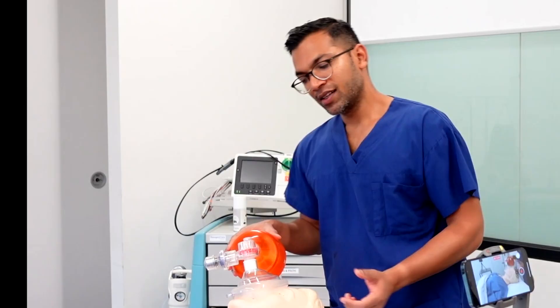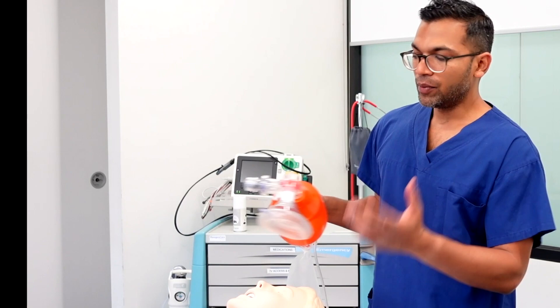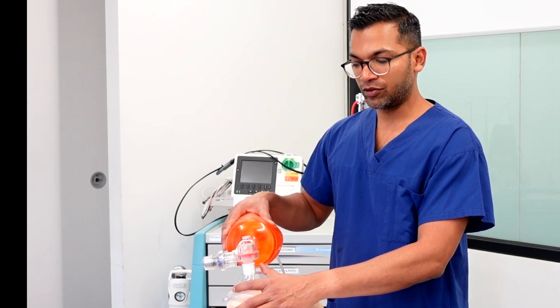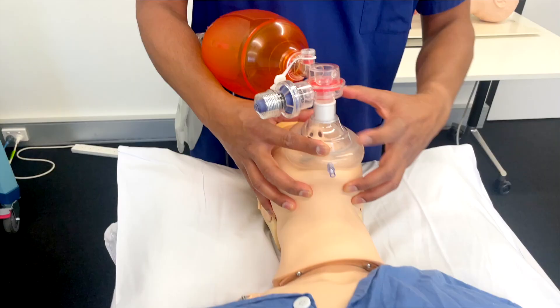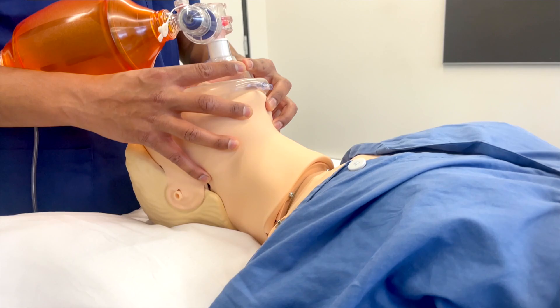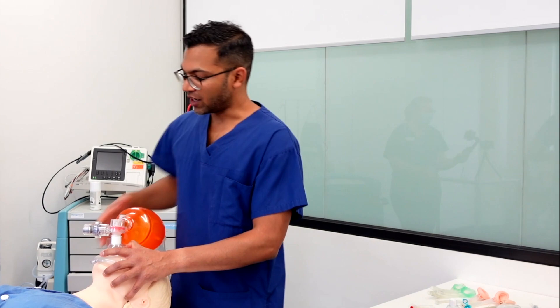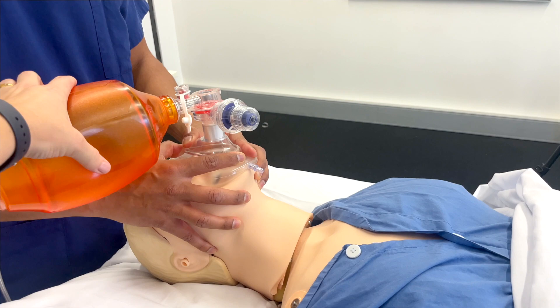Sometimes the mask or the face shape will be different — for example, elderly faces have less structure, and patients without dentures may have the face falling away. In these cases, you need to adopt a different grip. The most common variation is the two-handed grip: a double CE grip with a C-shape and E-shape on each side, mirroring each other. Again, you're lifting the face — not pushing down. When using two hands, you'll need an assistant to squeeze the bag while you maintain the seal.